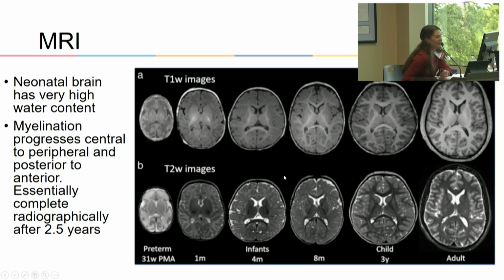All right, so MRI. MRI is much more detailed, as you can see. And I wanted to talk a little bit about how MRI is actually performed, like the physics of it, because it's important, since a lot of the neonatal brain is water, because it hasn't been myelinated yet. MRI is basically magnetization of protons. This is my very simplistic understanding of it. The magnet aligns all the protons, and then it stops the magnetic field and they relax back.